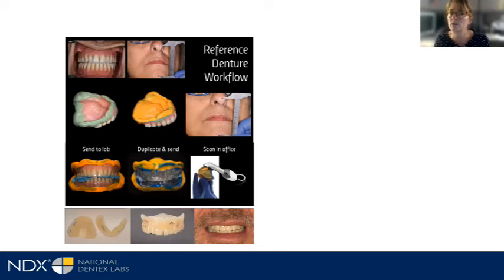Otherwise, if your impression wasn't that great, or the patient did not have an existing prosthesis and you scanned intraorally, you might just be getting back, worst case scenario, a custom tray that you then could take the impression with and then scan the impression. So people are like, well, why would I scan an impression versus just sending you the impression? Well, it's all about that workflow, right? And if you want it to be digitally designed and a complete digital workflow, once that intraoral part of the scan is achieved.